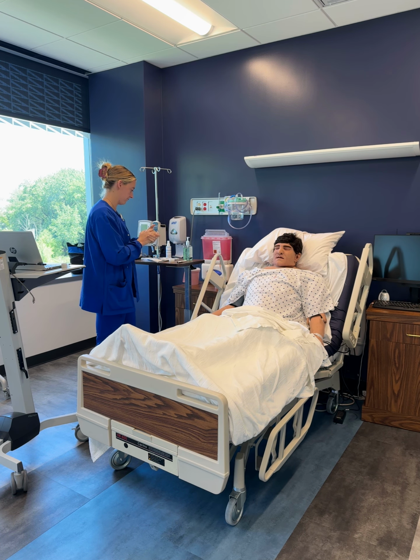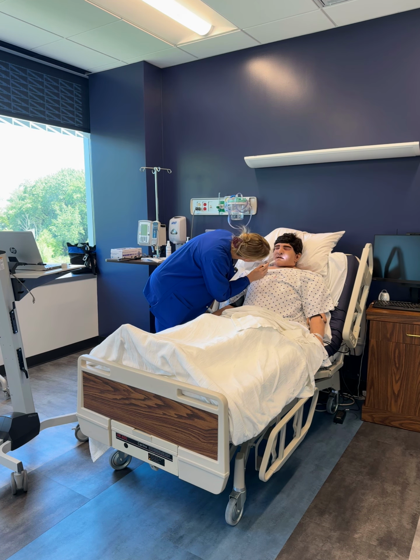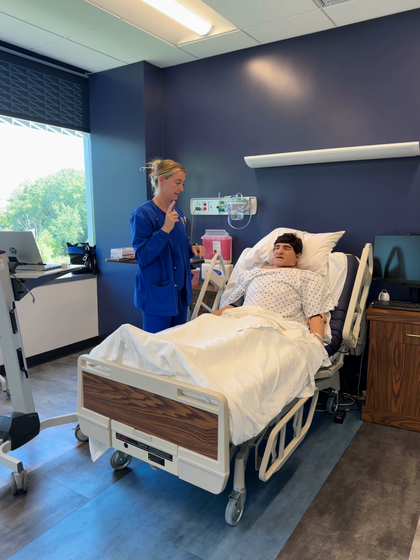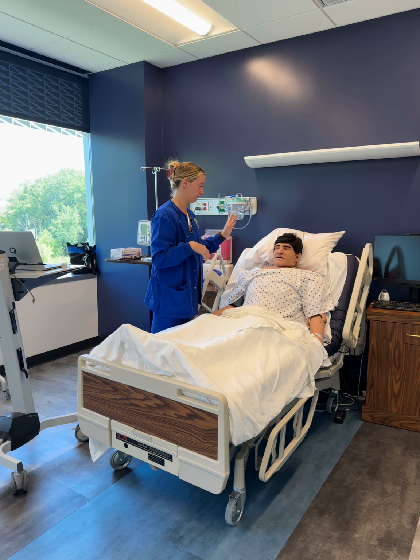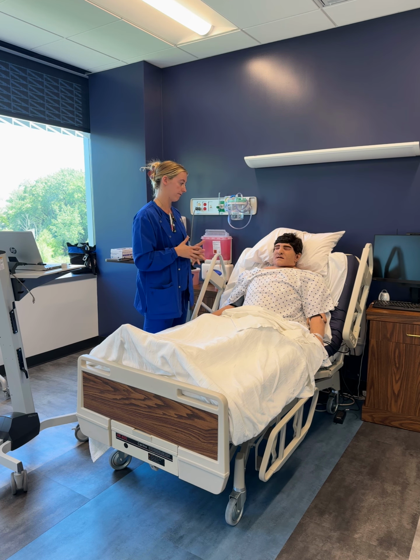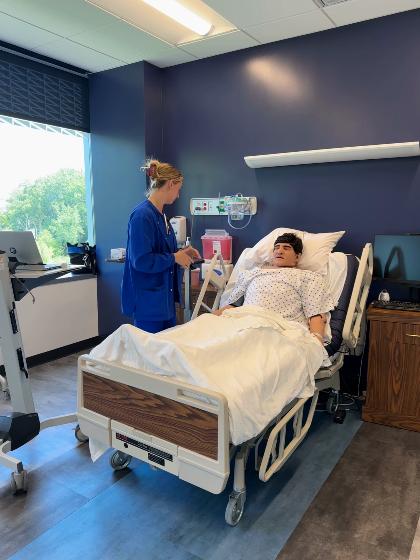I'm going to inspect the nasal passages for any nasal polyps, obstructions, septal defects, or mucosal irritation, which I see none. I'm going to then have the patient do the test for patency, holding one side of the nares and then the other. When the patient did that, it seems as if the right side is better for the insertion of the NG tube. I'm going to ask the patient if they've had any trauma to their nose, any surgeries, or any nosebleeds. The patient denied all of those.